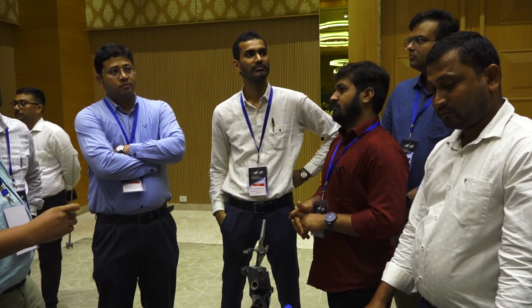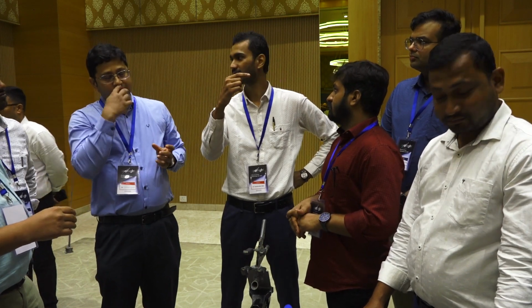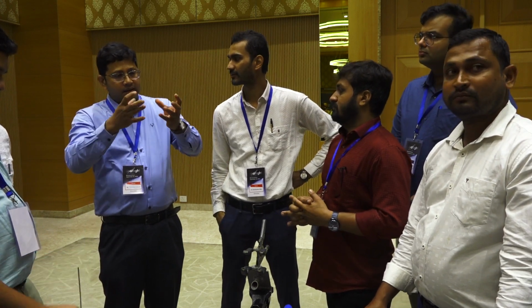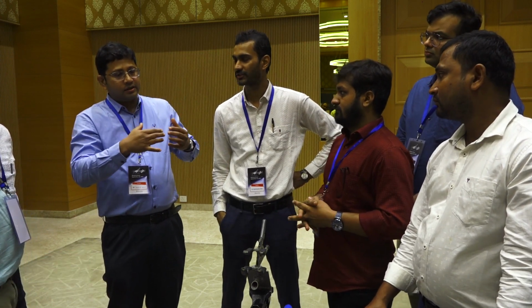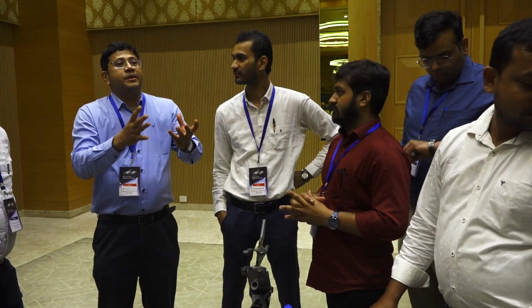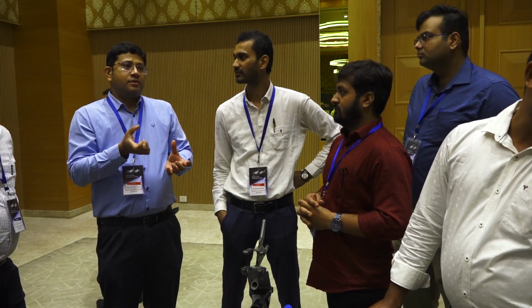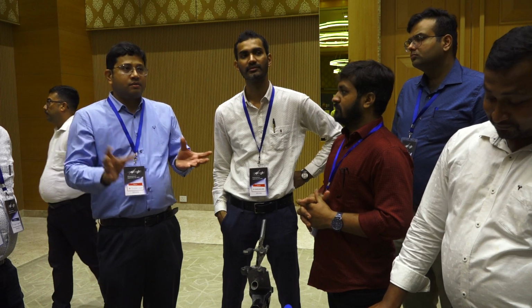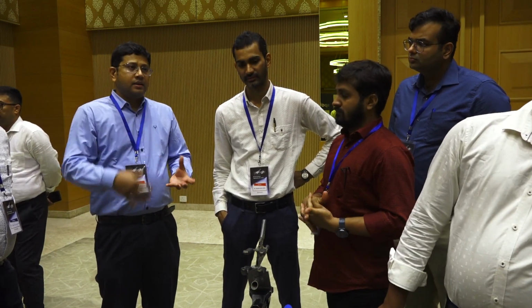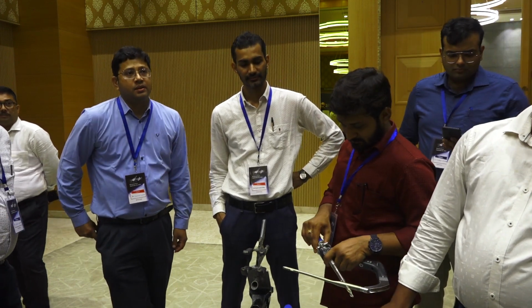Lateral wall compression, large posteromedial fragment in the head. Yes. Sometimes the lesser trochanter is like a big chunk. It is also extending to the subtrochanter, posteriorly. So that's a very big chunk to lose. In those cases, you have to reduce it and fix it. Otherwise, it is going to fail because that is the weight bearing area, the posteromedial aspect of the calcar. And if you don't reduce it, in those scenarios.